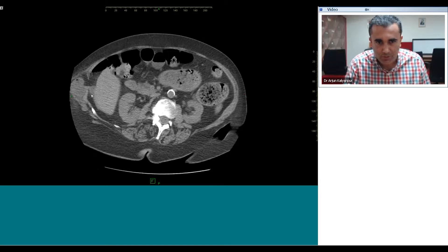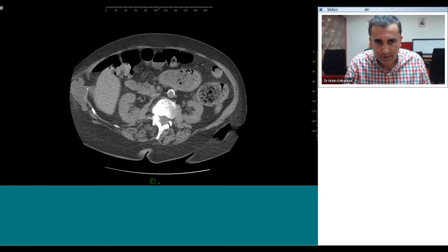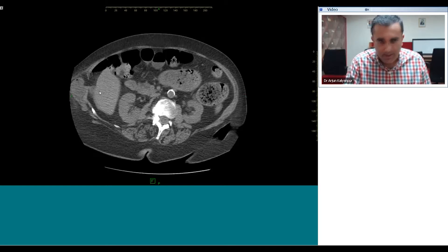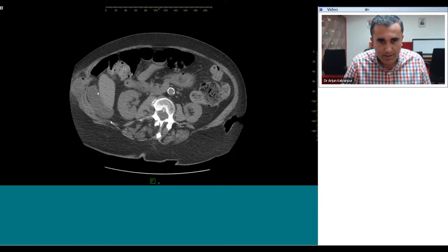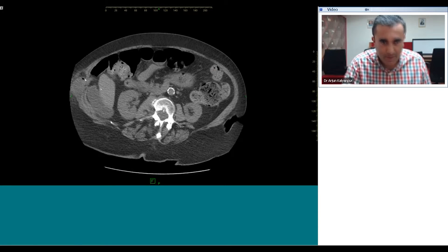This is a ventral hernia in the right flank, and as we can see the bowel has become constricted at the neck of the hernia — that is where the transition point is in place.